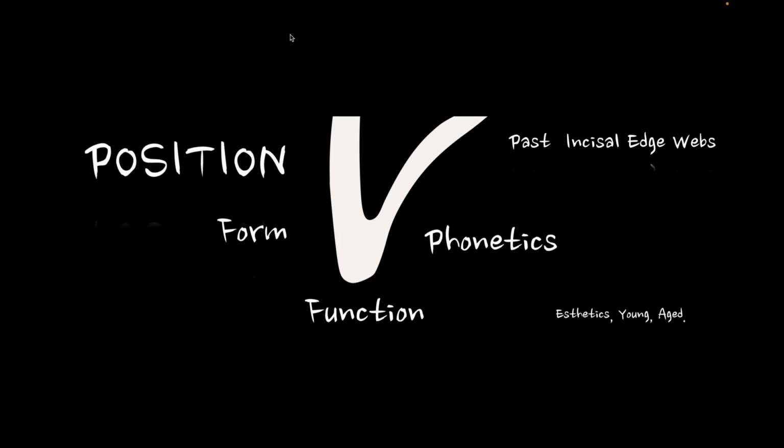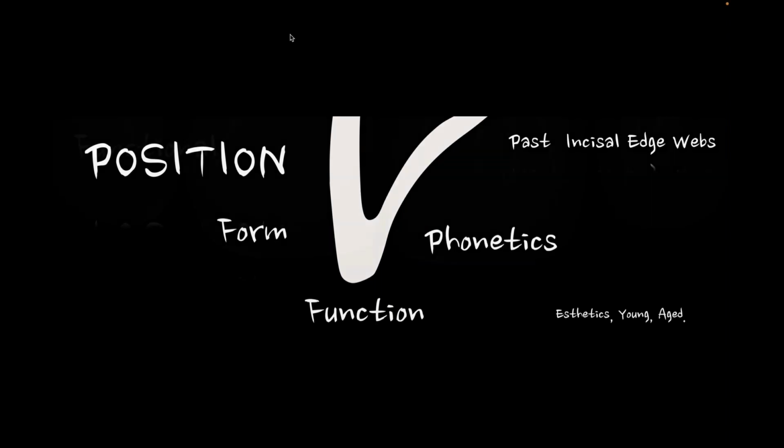And I would love to tell you that every incisal edge, I use EE9 or blue water, or I use the same translucent blue, and I use two mamelon materials. But boy, that's so not the case. And that's why it makes it so difficult for me to talk about such a specific area, because it's really very pertinent to the patient and what I'm looking to achieve for that particular patient.